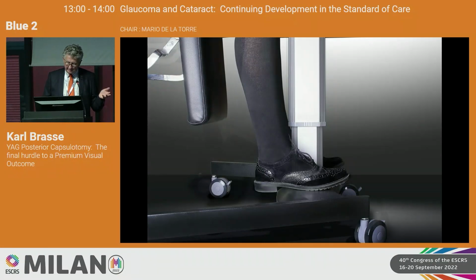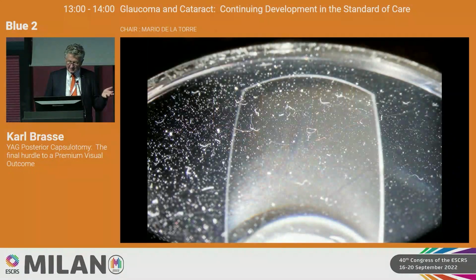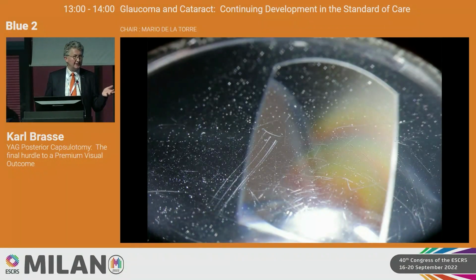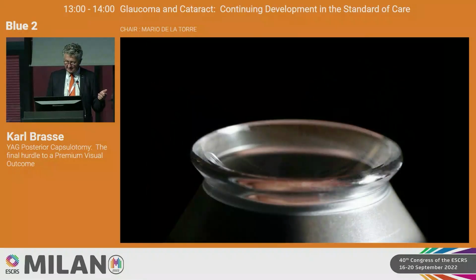Yeah, the technique: patients have to sit comfortably. Patients with short legs have problems. I've created this wooden structure. If you look at your contact lenses, they are dusty and scratchy like this. I'm sure at any university department where there are 20 juniors, pick the lenses and look at them, this is not good for quality. A contact lens has to look like that and can be easily achieved. I describe it in my brochure.